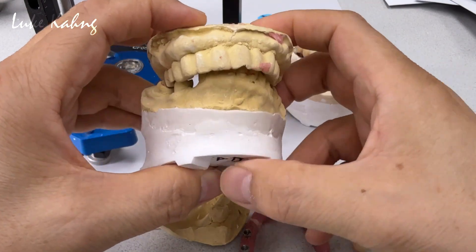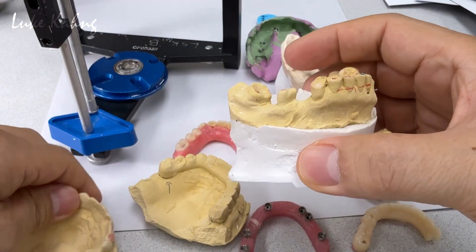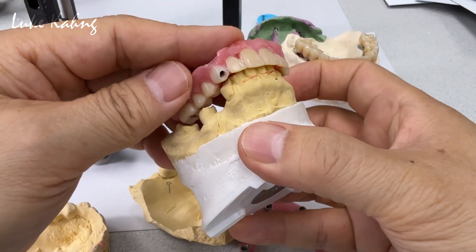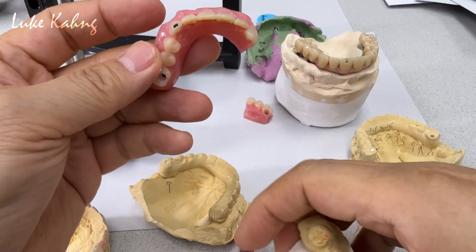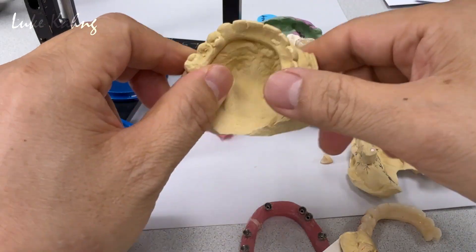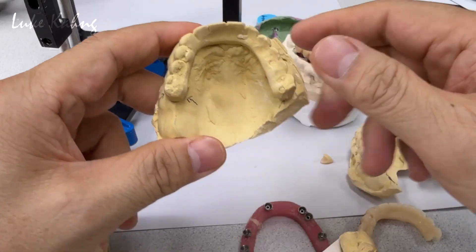To get the proper appearance for the anteriors — not all this contour — we fabricated a wax-up, bringing the teeth in a little bit more. Then they tried it in the patient's mouth and made a model, but they were still not happy with it.